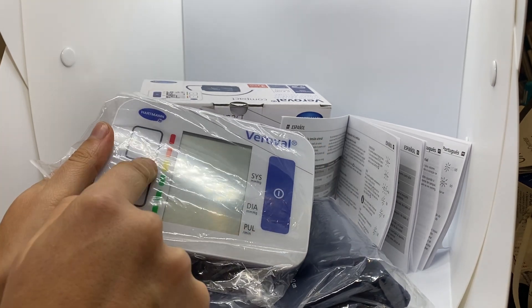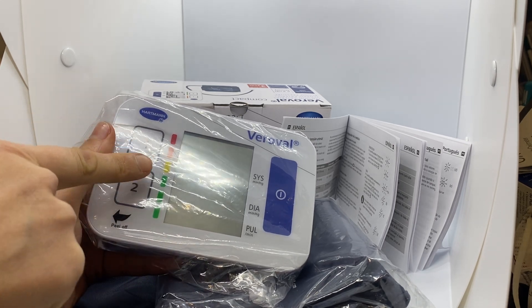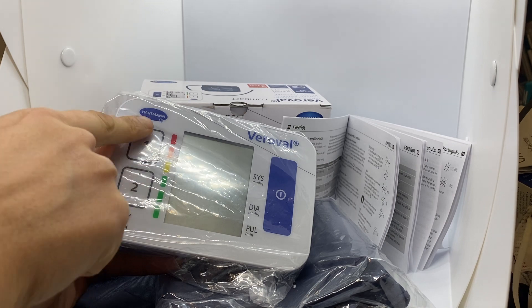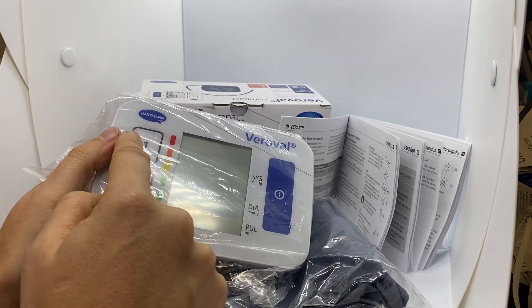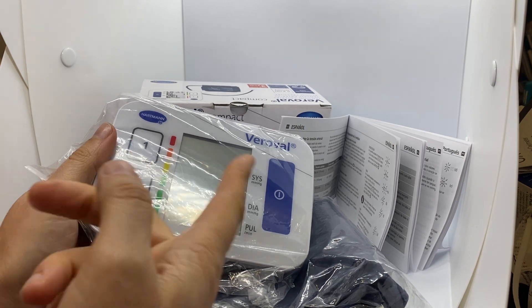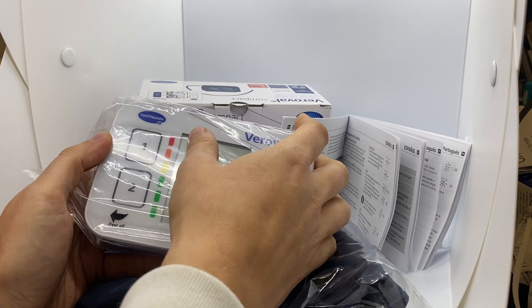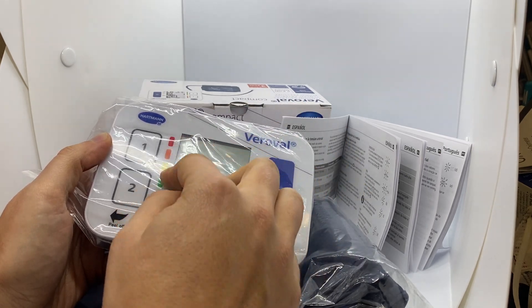It has the possibility to have memory for two people — memory one for your mother, for example, and memory two for your father — and it has another thing that is very useful.